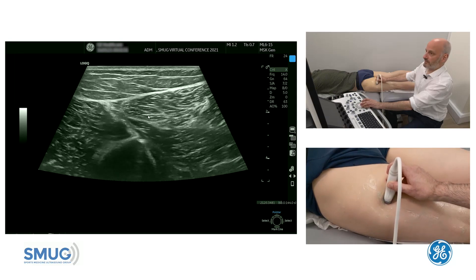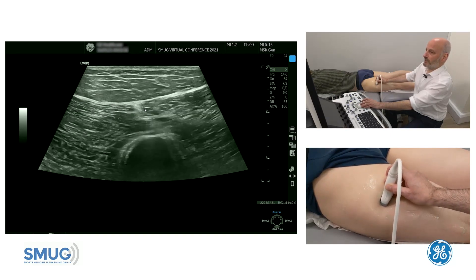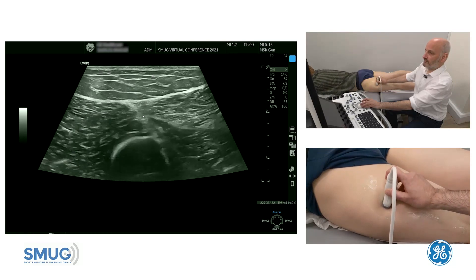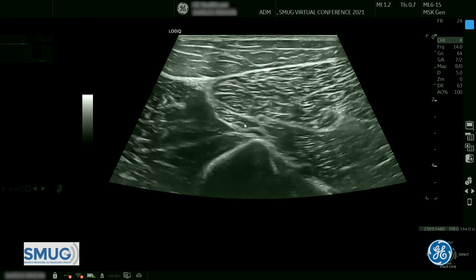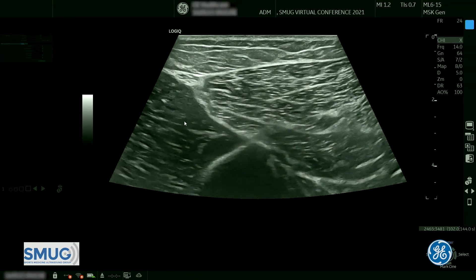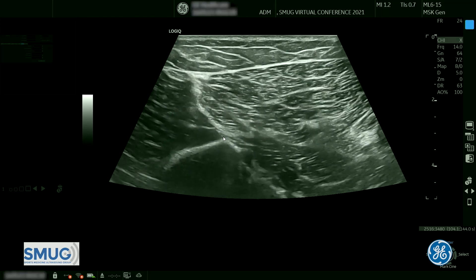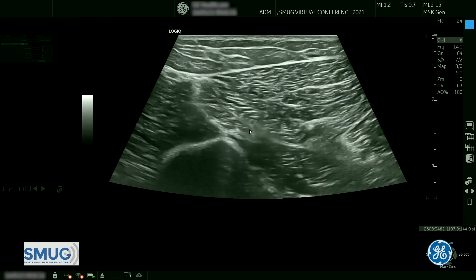That's the long head of the biceps on the posterior side of that compartment. We keep our eye on that fascial plane, and as we go distal we look for a column that comes in between what was the long head of the biceps and the lateral compartment. There are two fascial planes — the first one here and the second one next to it — and we refer to those as the tram lines because they're pretty parallel.